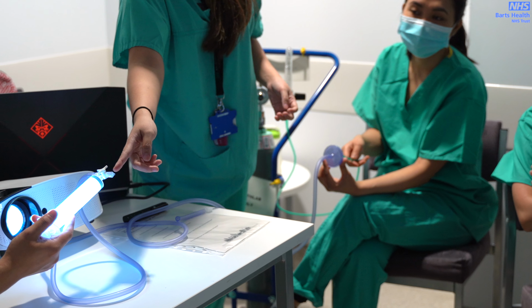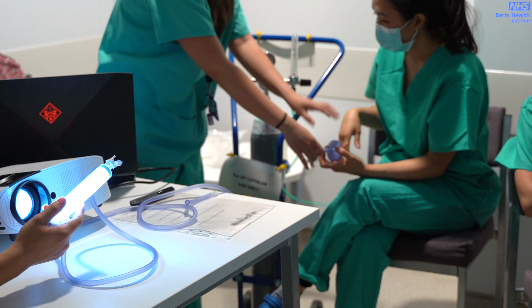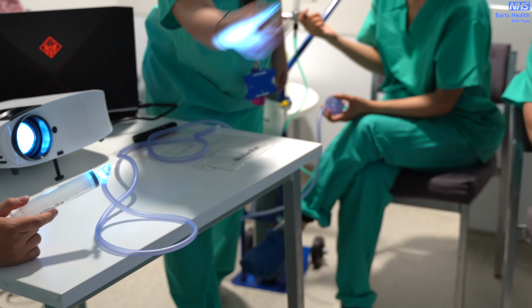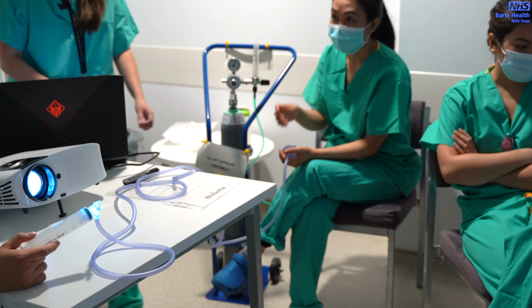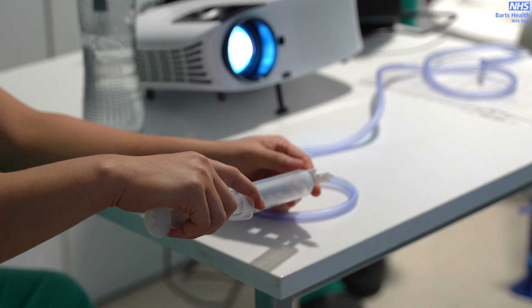As a scrub nurse, you will give the unsterile end to the circulating nurse. And this other end will then be connected to the JR4. That's sterile now, so starting from here, this will be sterile.